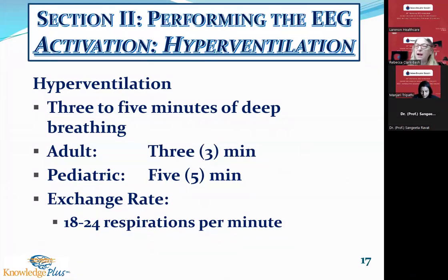5 minutes, another tip that I like to use is that imagine with the child, say we're running a race. And periodically throughout the HV, if they start to be lazy about it, they're not really doing the job that I need them to do, I will say, I'm winning the race, and you need to run faster. So again, with their eyes closed, they will continue to increase their breathing rate.